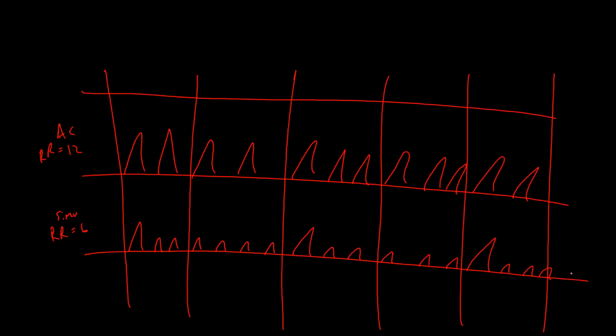And that's a great thing about SIMV, because we can drop that mechanical ventilator-driven breath low, and then we can adjust the pressure support up or down, whatever we want, to offload as much or as little of the work of breathing onto the vent. So basically we can just adjust how much support the patient's getting. If they need more support, that's fine, turn it up.